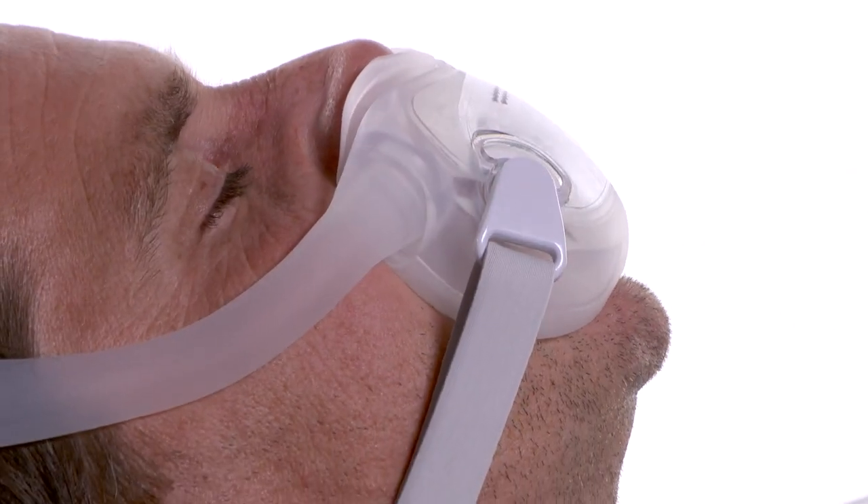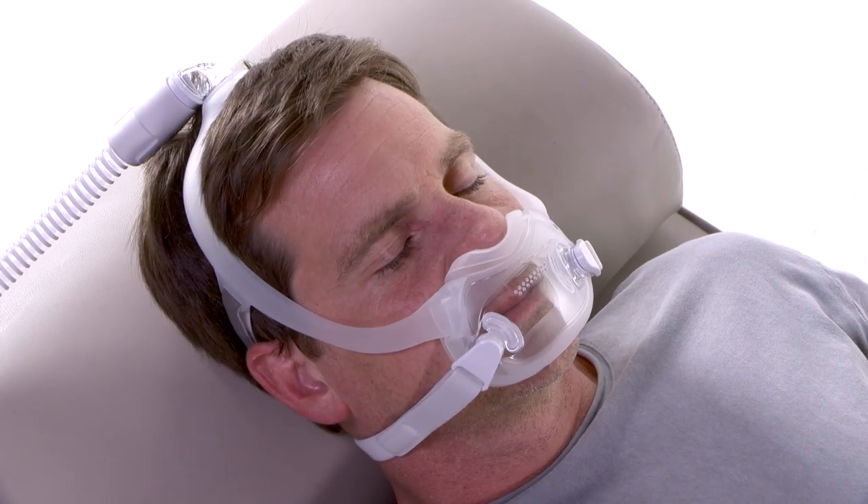Never over-tighten the headgear. If too much air is escaping, try another cushion or frame size.